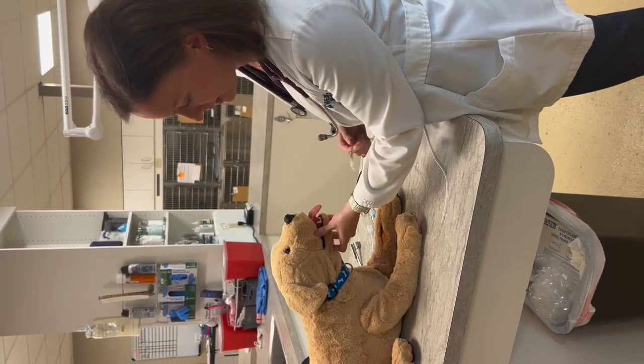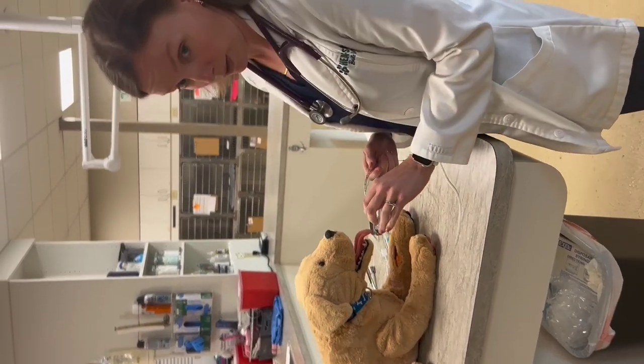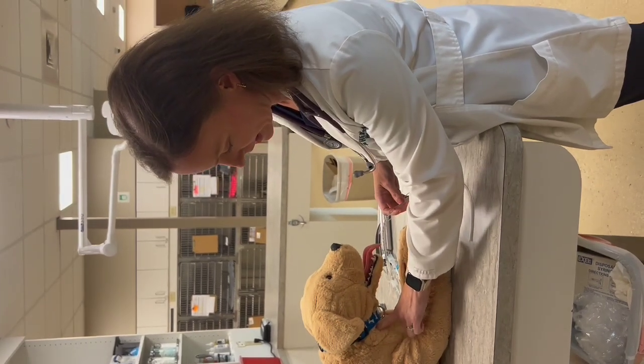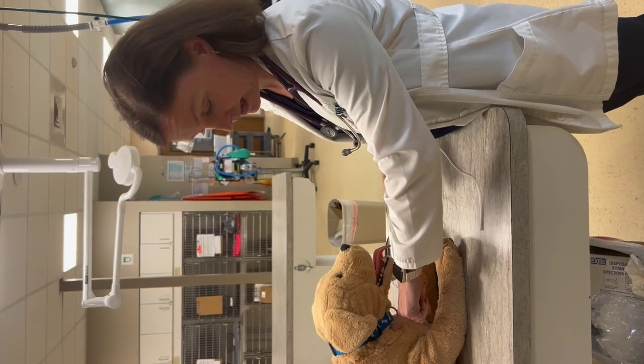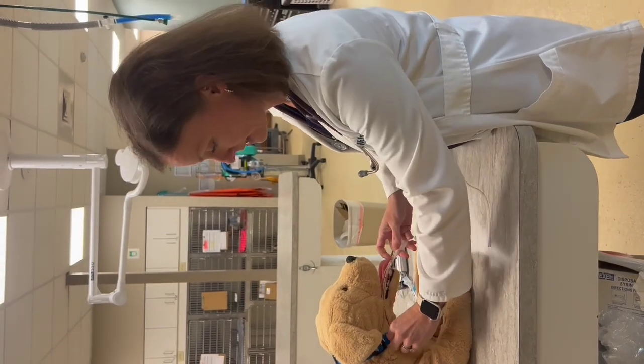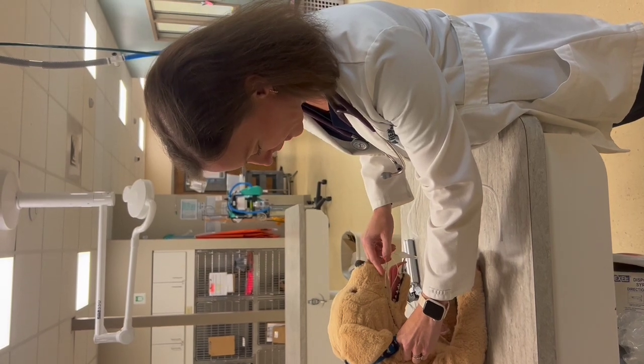The next thing you want to do is measure the depth — how far you want the tube to go in. We want the tip of the tube to be at about the thoracic inlet, which is right around here. I like to measure before I even try to intubate, so I place it at the thoracic inlet and look to see where the tube matches up.